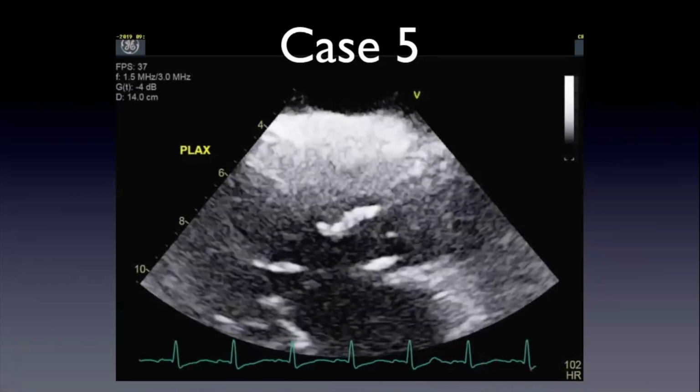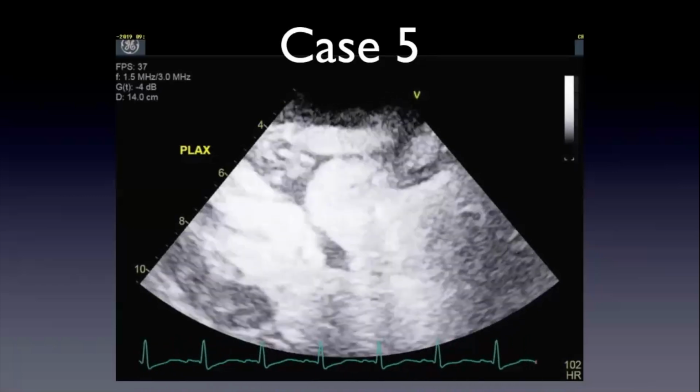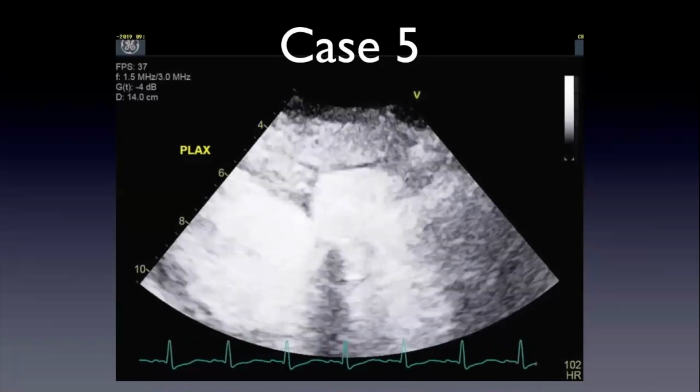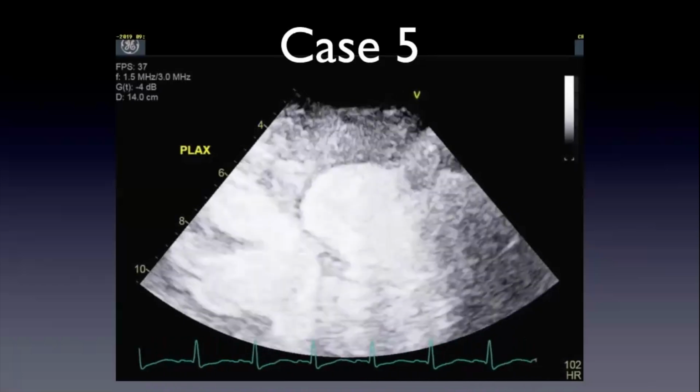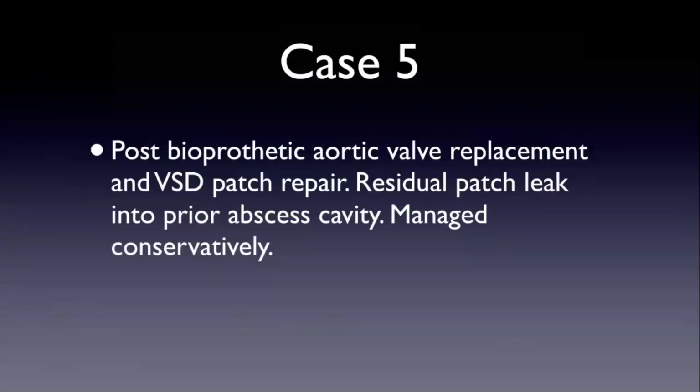Here it is again. Yeah, and you can almost see a bit of spurt going into it as it completely fills. So it's a big cavity leak. Okay, so this is a residual patch leak.